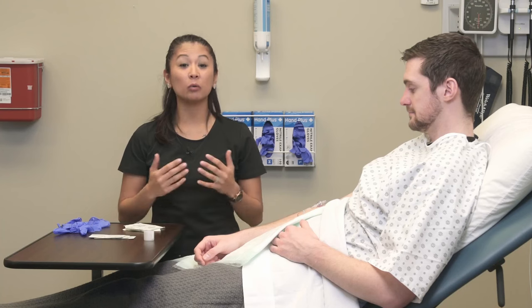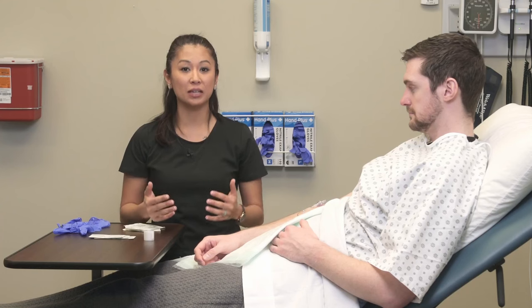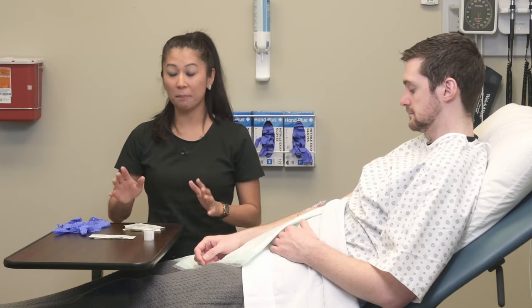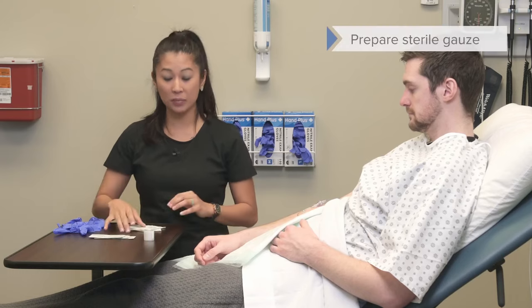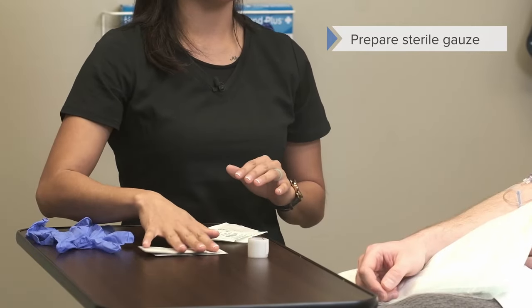Now let's talk about the removal of an IV in a practical demonstration. This typically happens when treatment is complete or the patient gets to go home. Make sure you have your supplies: gauze pads, alcohol pads, and tape.